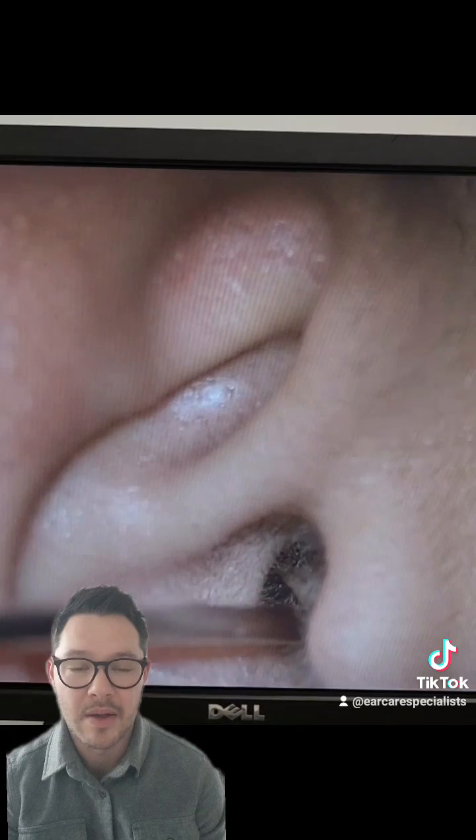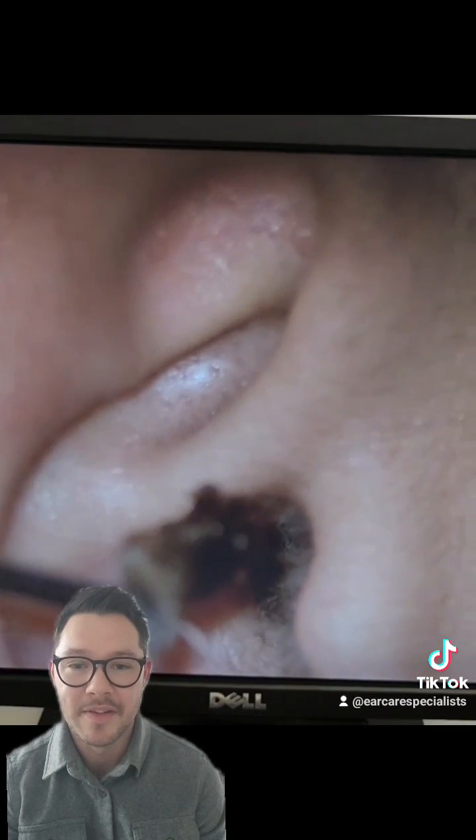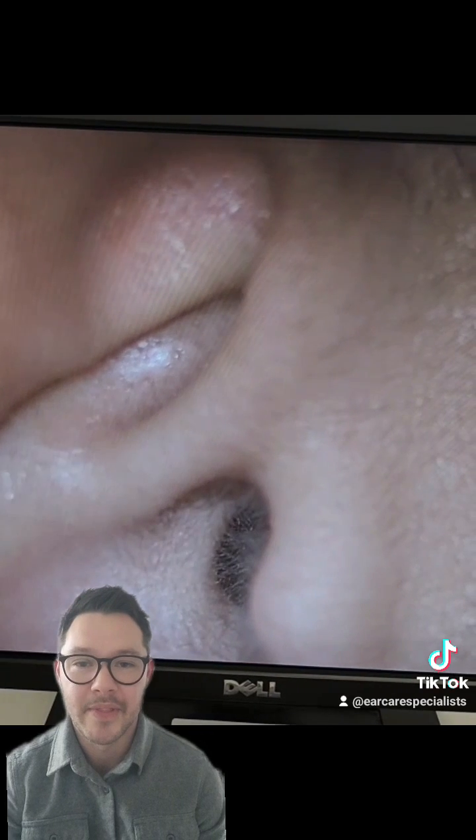Here you go. As it comes out — about one and a half centimetres, pretty big. It'll certainly feel a little bit lighter after this one. There you go, thank you.